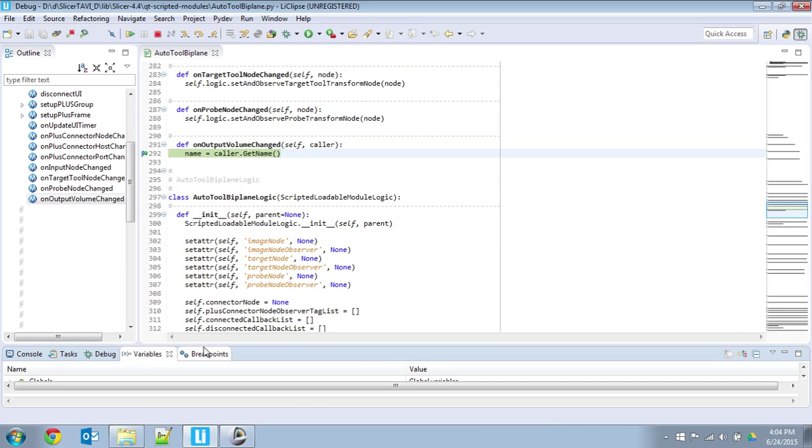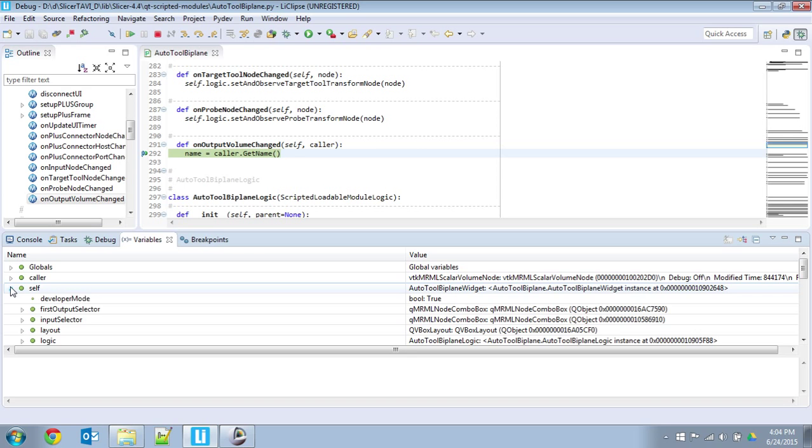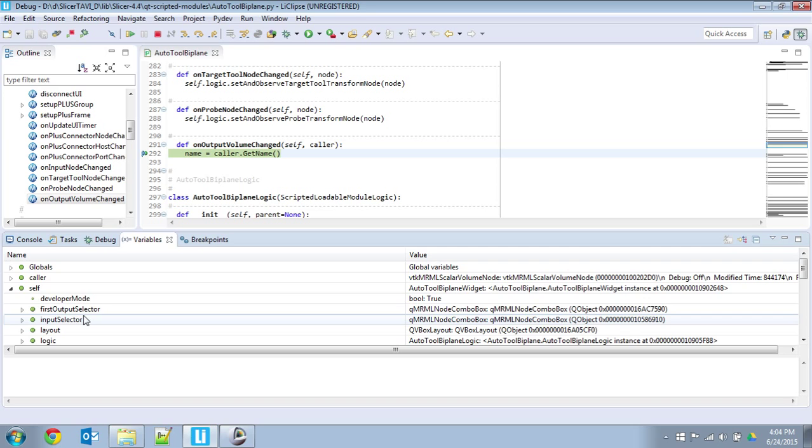I'll just make this a bit bigger for you. Hopefully you have a multi-monitor setup and you can move these things to another monitor or whatnot. But if not, you can resize. So we can explore these variables. Here's the self, which is an Auto Tool Biplane widget that has some member variables. Here's a combo box with different settings. So you can explore your variables.